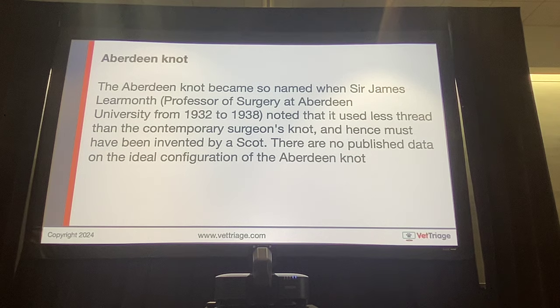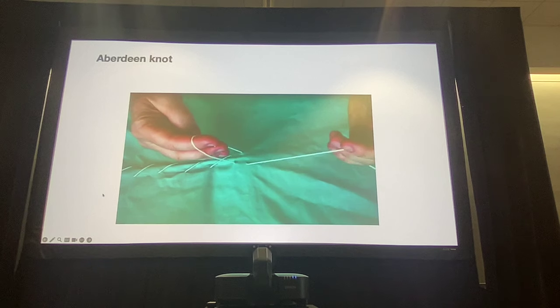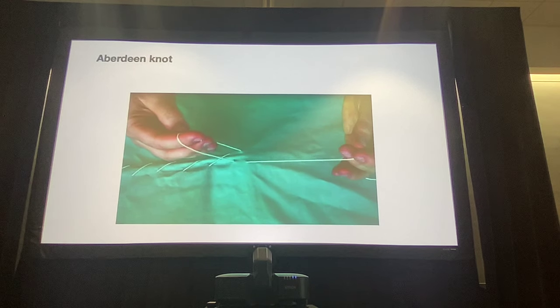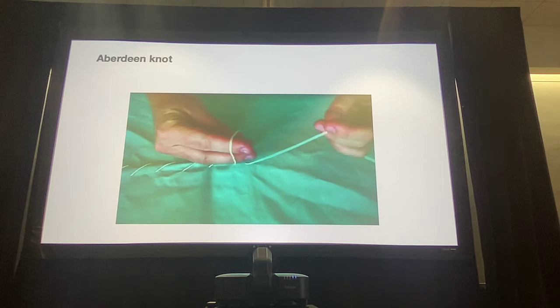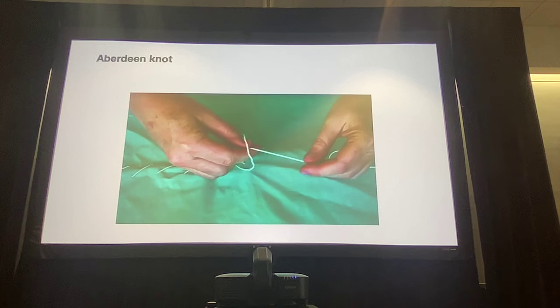Now we're going to go to some sutures that I don't ever use. These are much more difficult, but it'll be fun to test your skill set and what you've learned so far. Some of you may have used this in practice, but the ones we went through are the essentials. Those are your basics you're going to use for pretty much everything. There are other more niche sutures, like how to close muscle and fascia, but those are for specific cases only. Everything else you've learned so far can be applied to everything. So this is the Aberdeen knot. We have this video, and then another video afterwards to show it to you. We'll see what you think about it.